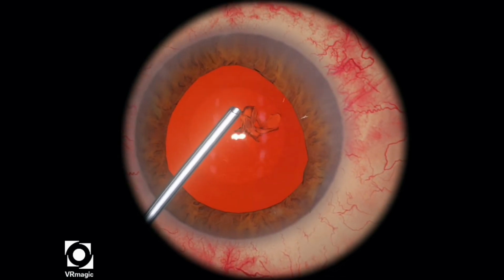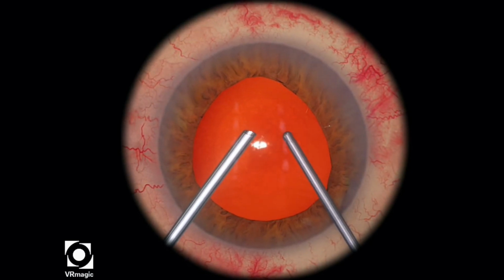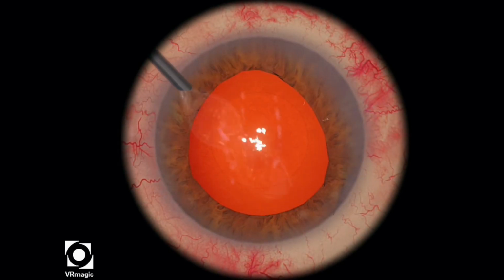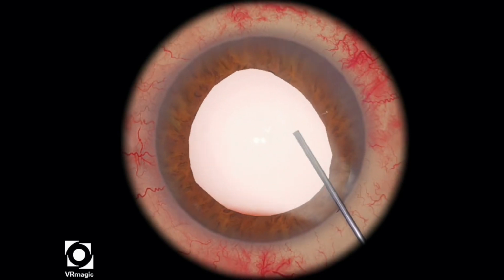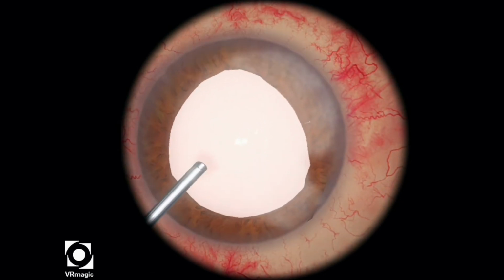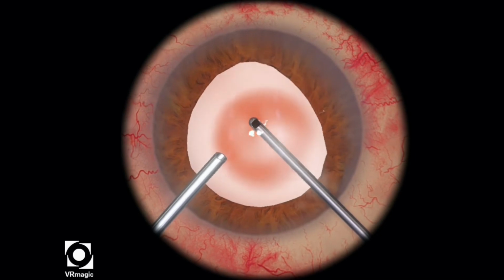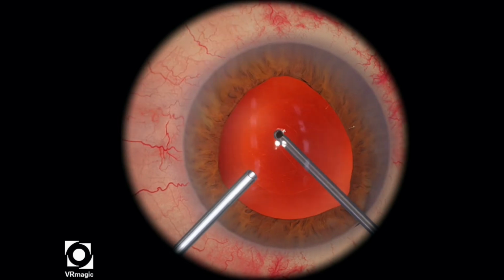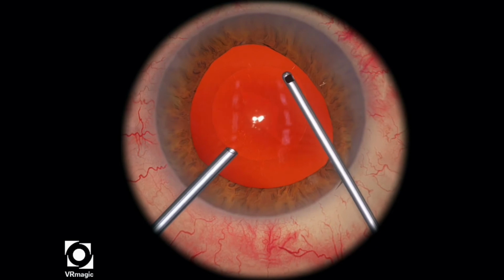So here I'm just using my technique, low flow rate, so about 5 to 10, lower bottle height at around 55, and then making sure that my irrigation is always on continuous. So I'm staining again. You notice that there's still a little bit of vitreous left there at the 3 o'clock area. And I'm going to be getting after that in just a second. There's still a little bit of vitreous there, as you can tell, directly below the posterior capsule. So I have to cut that away.